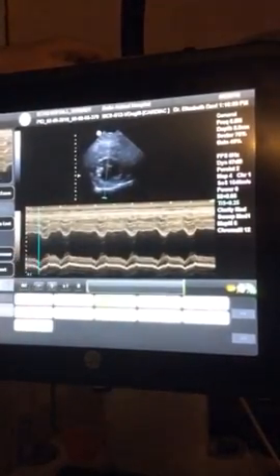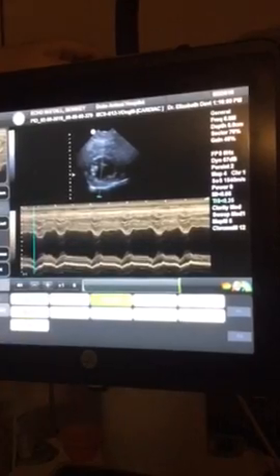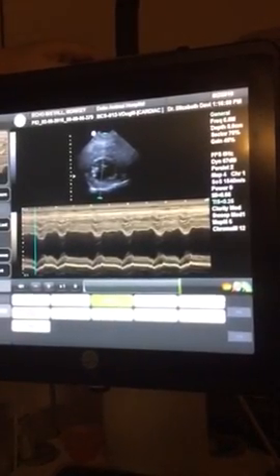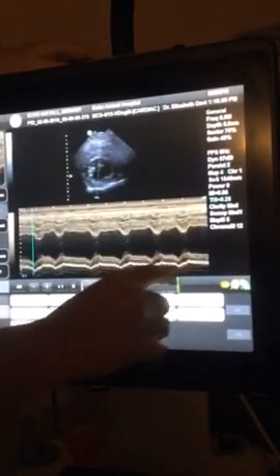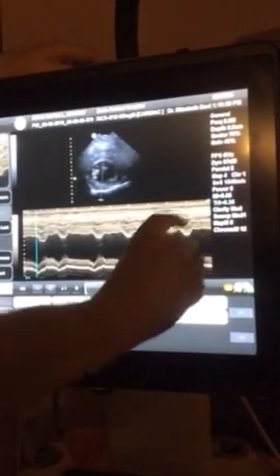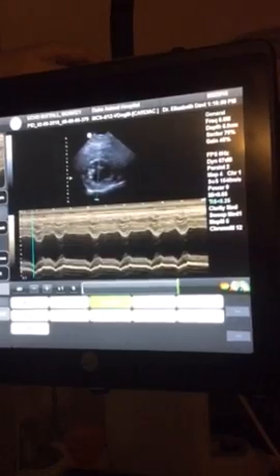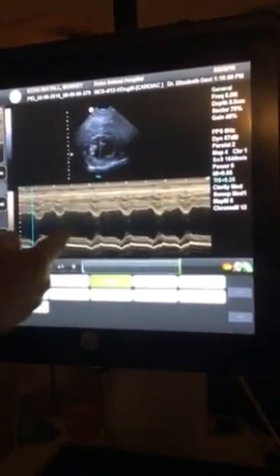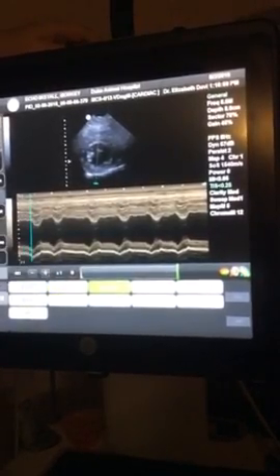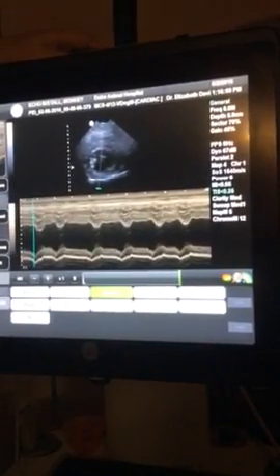That usually means you have mispositioned your calipers. And I won't know that till the end? You would know it at the end of your measurement. As soon as your table pulls up right here and gives you your EF, you'll know. If your first one was 60, and then your second one came out to 40, then you know you have an issue with your caliper position.